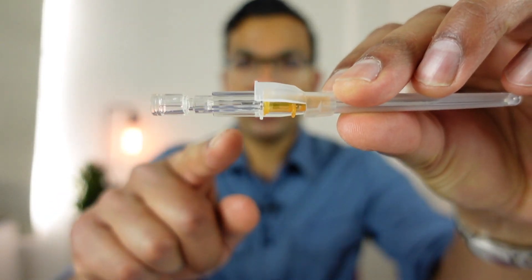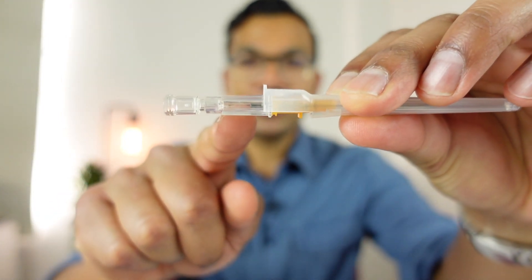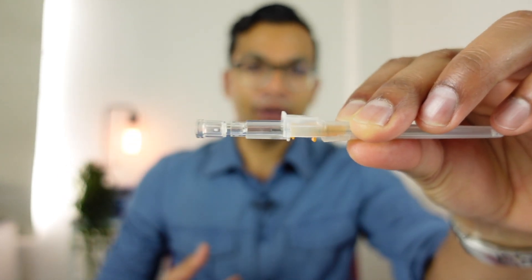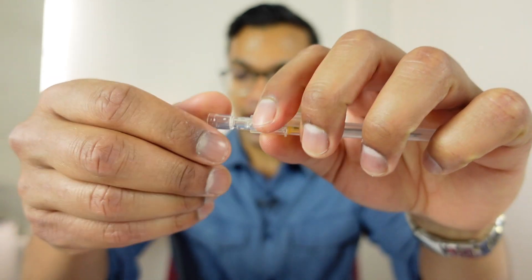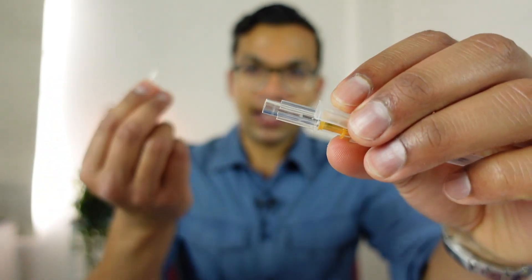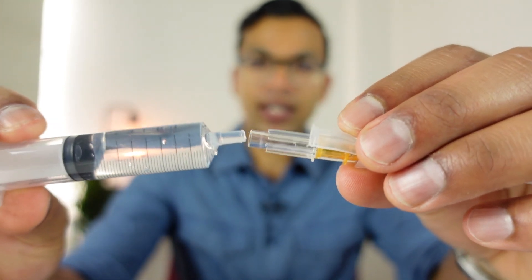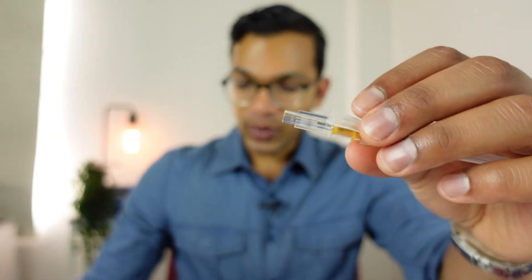So the first question is: why would you want to put saline in your cannula chamber? Right now here we have the chamber of the cannula, and we're going to fill that with saline - that's going to speed up the process of flashback. The way we do that is essentially take that little cap off and put some of the solution in there, and I'll show you that in more detail.